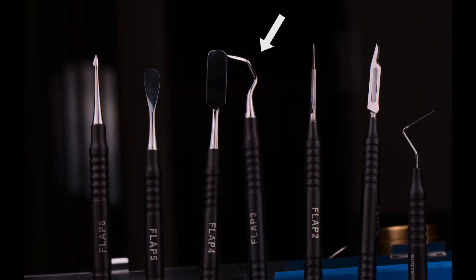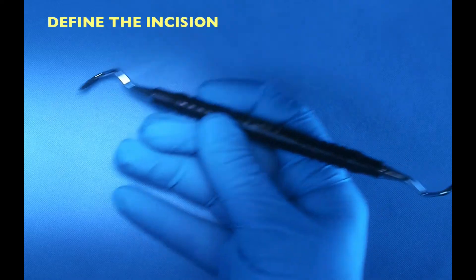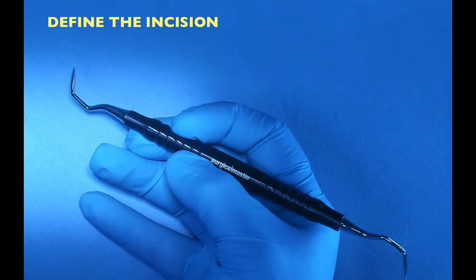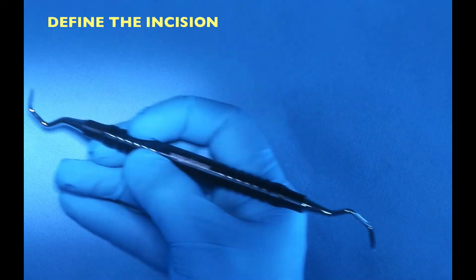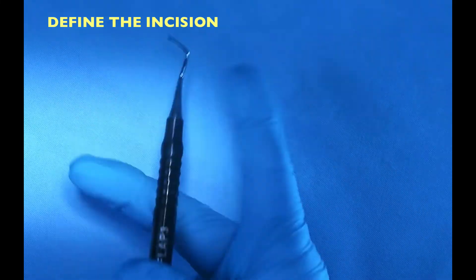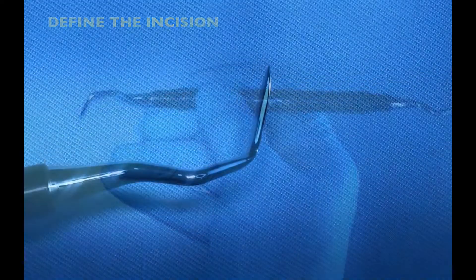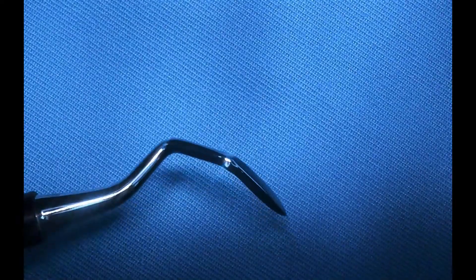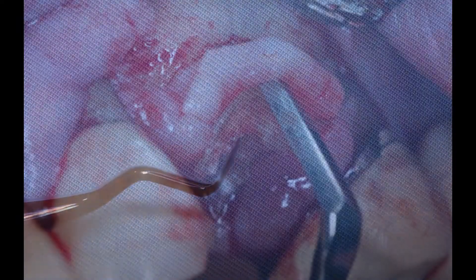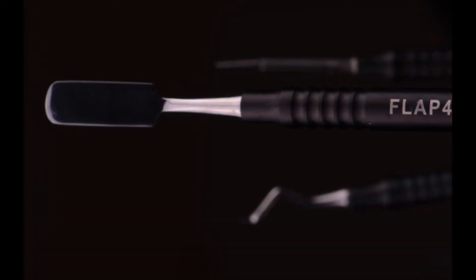The third instrument is a type of knife, like the Orban knife, that is meant to define the incision. When you're making an incision with a number 15 blade, it touches tooth structure and bone and becomes dull — your incision may not be fully defined even if the blade is new. The Orban knife will define that incision and make flap reflection easier. I also use it for removing discarded tissue.